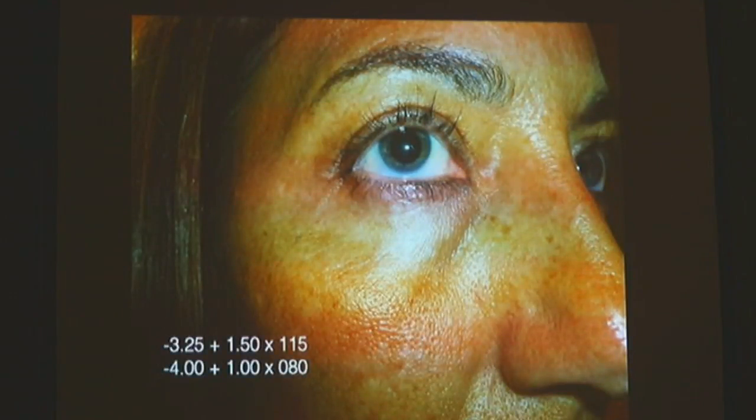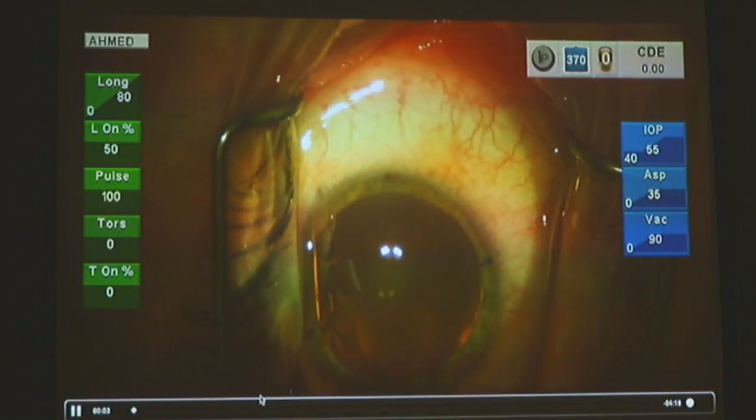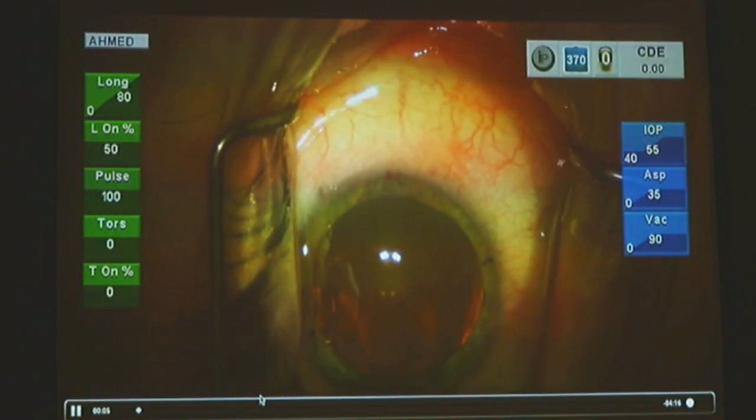And you can see now he has a job, he has a girlfriend, he's making money, you know. He's very happy. Because these patients can be very bothered by glare like this. You know, it really affects your quality of life when you can't go outside and you're always closing your eye and squinting. Like this patient, who is a young woman who had trauma to the eye with a cataract and an atonic pupil. And in this case, she was used to wearing multifocal contact lenses.